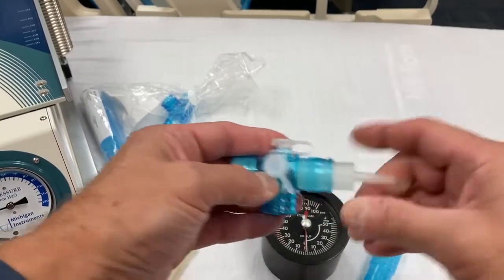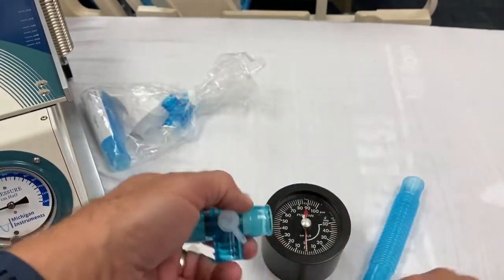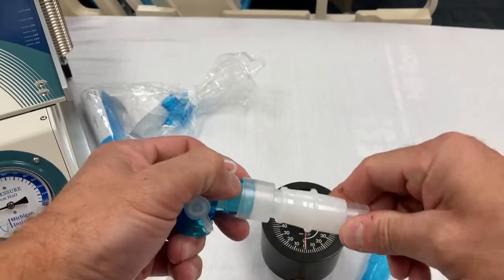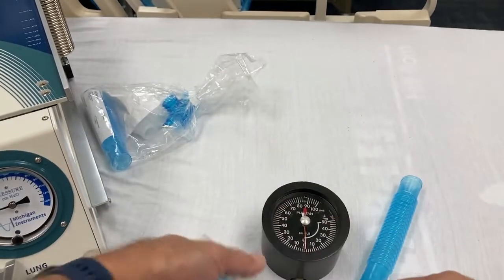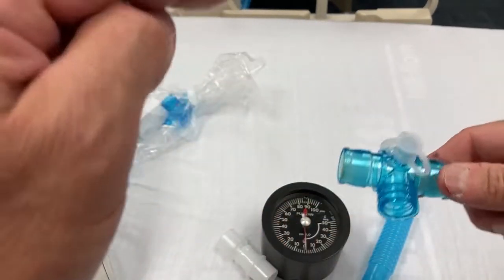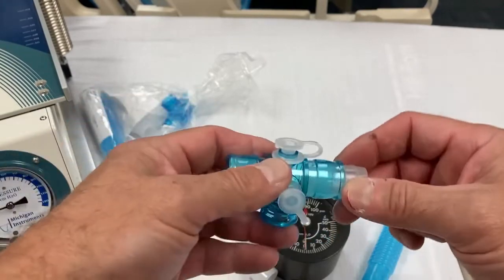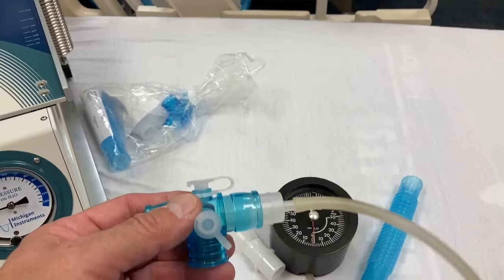Now this can be really tight and difficult to get in there. This one's not, because I've already pushed it in there before. But if you need to, you can go ahead and put your parts and pieces in there, and that makes it a little easier. I'm just going to go straight into it for this one, and we'll hook our NIF meter to it. Now, if you think about it, when they breathe in, they're not going to be able to pull any air in, because this is going to close and they're going to be pulling through this tiny little tube, and this doesn't allow airflow through it.